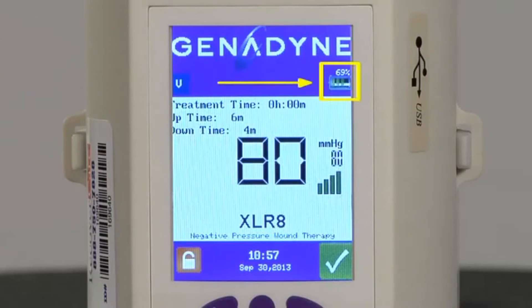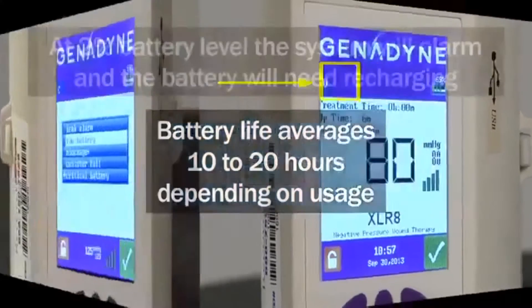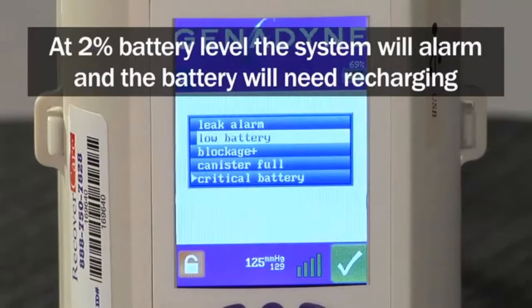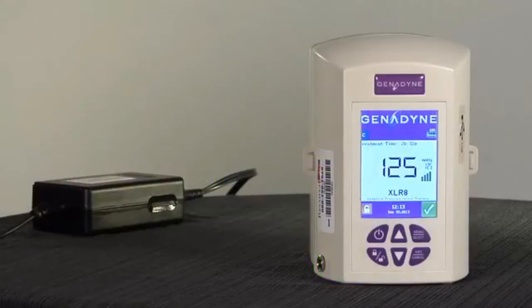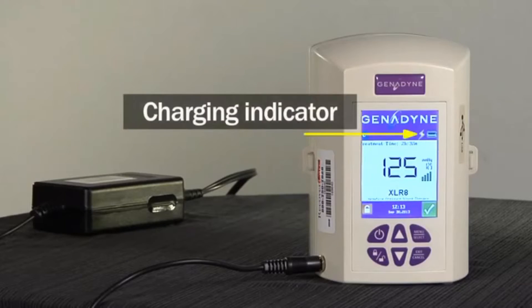The battery icon bars provide information on battery life. Battery life averages 10 to 20 hours depending on usage. When the battery reaches 2% life, the system will alarm. At this point, the battery typically has less than 30 minutes of life prior to the pump shutting down and should be plugged in to recharge. It is recommended to charge the unit when being used at the bedside to keep the device fully charged.